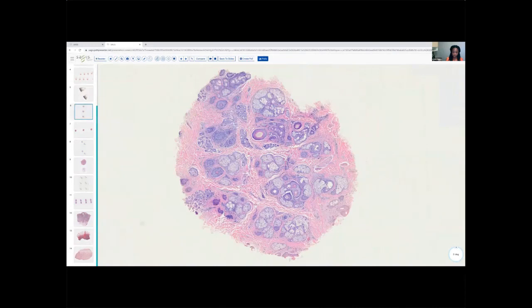And we had a good amount of inflammation in that example. But again, what was so striking was the absolute loss and atrophy of those sebaceous glands at the very same level. And we have this example here. This is alopecia areata. The sebaceous glands are just not lost in that way. They're quite nicely preserved, actually. So again, I just want you to keep that particular point in mind.